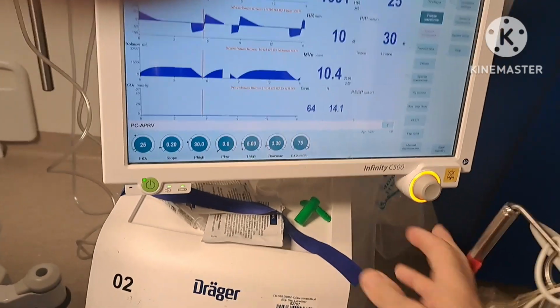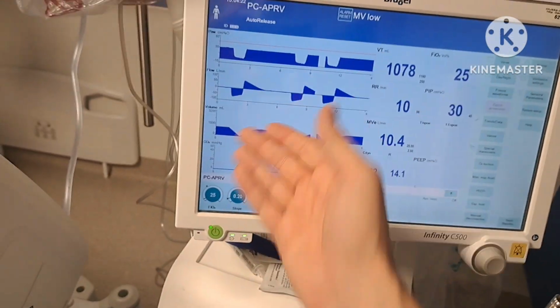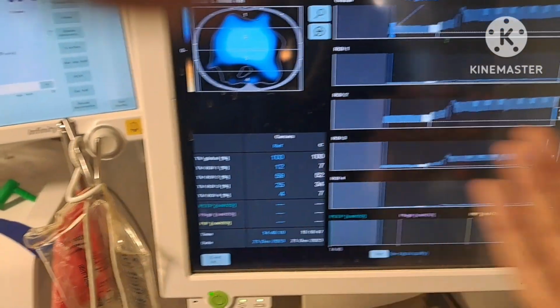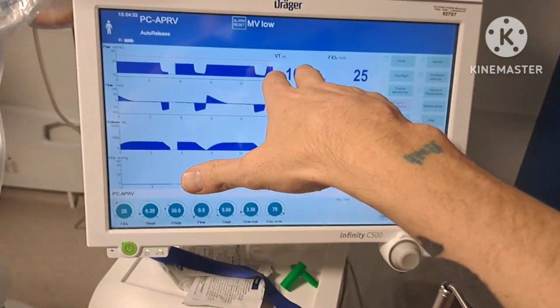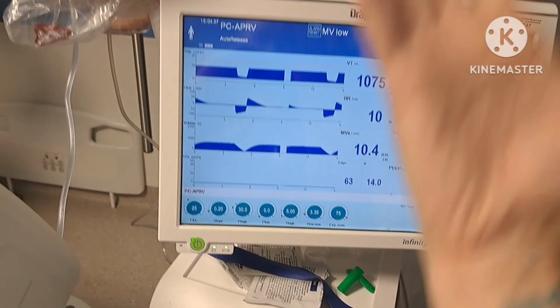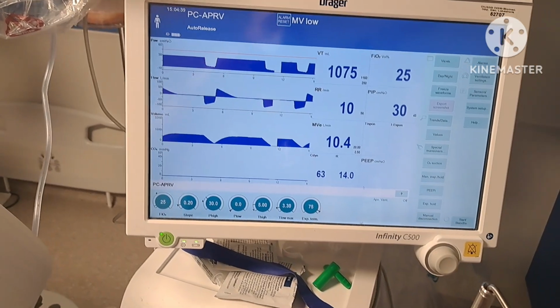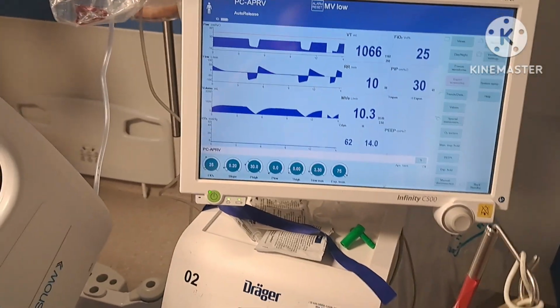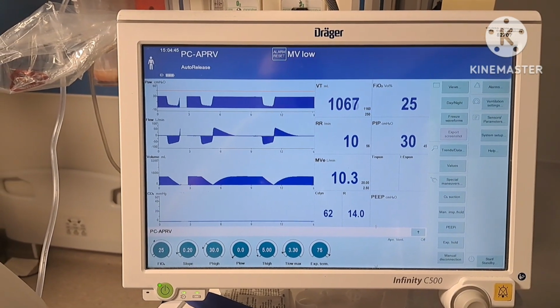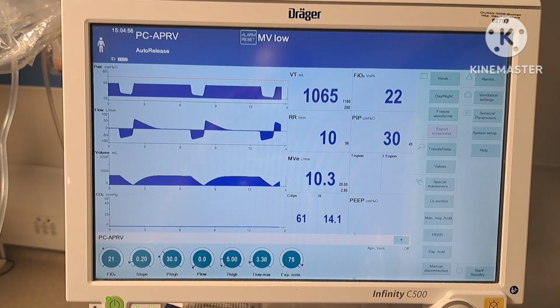What we're seeing probably is that with APRV, you're using pressure over time. You're getting a lot more recruitment, which is evident when you start using the PulmoVista a lot, and that these are just the volumes of a completely open lung being released passively to the ambient air for a very brief period of time. But more research has to be done on this.